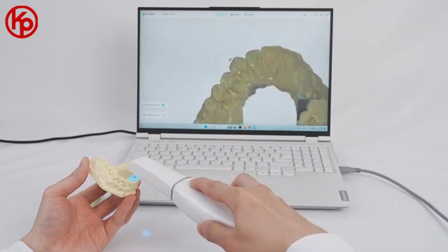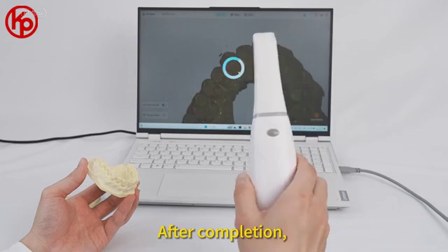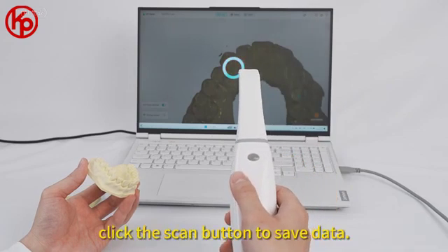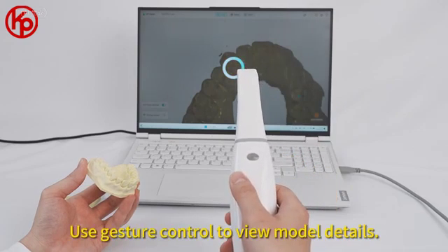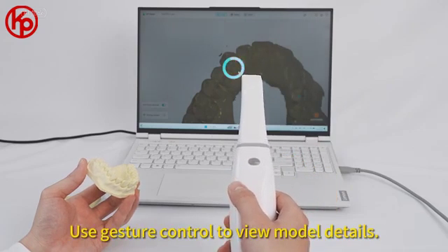Click the scan button to save data. Use gesture control to view model details.